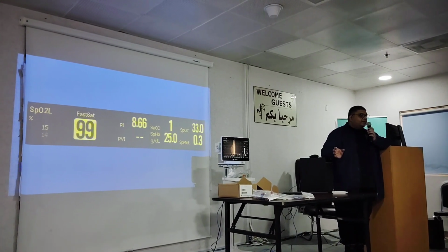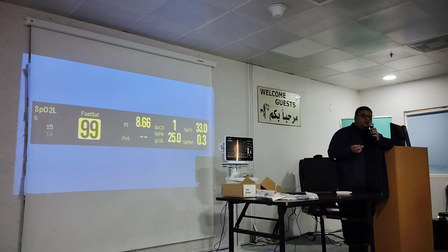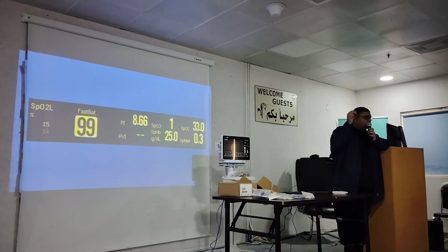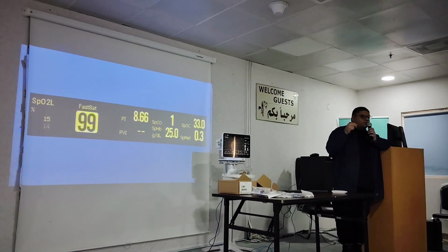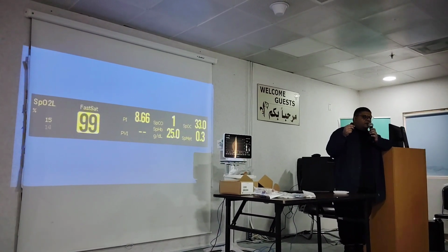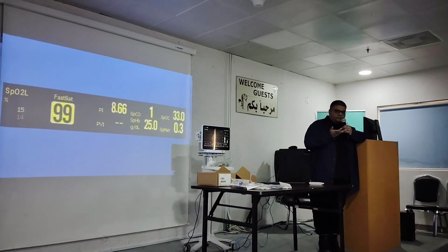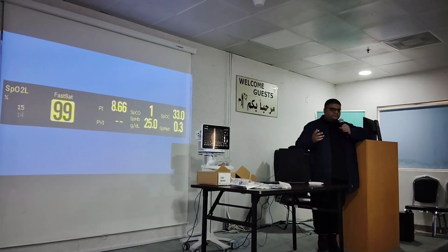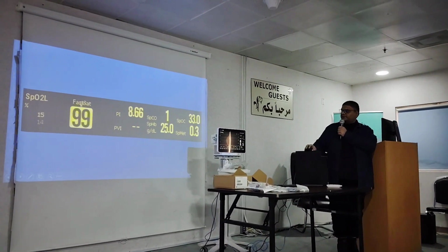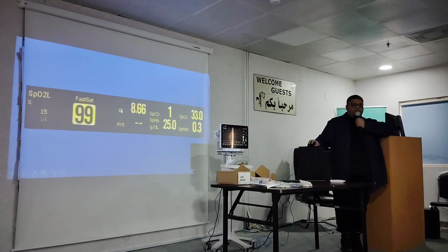Yes, but when there is a change in color, because there is extra pigmentation, it's not normal anymore. Maybe it's inflamed. So when there is discoloration, it will affect your SpO2 values. So use it over normal skin. But yes, that PI, perfusion index, should help you with that.